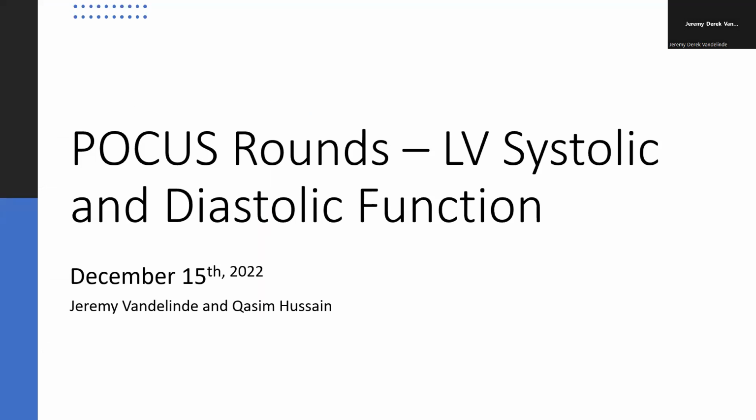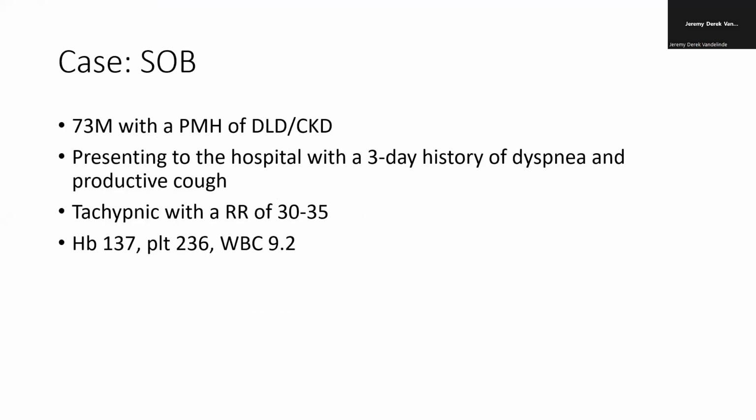The goal of my first part of the talk with respect to LV systolic function is really going to be what's an applicable overnight approach to evaluating a patient's systolic function on a bedside ultrasound. So in keeping with that, I'm going to focus primarily on subjective analysis of the LV function. First, I'm going to start off with a case and how we integrated our ultrasound assessments into the management of this patient.